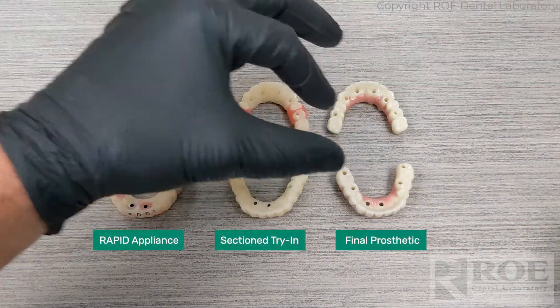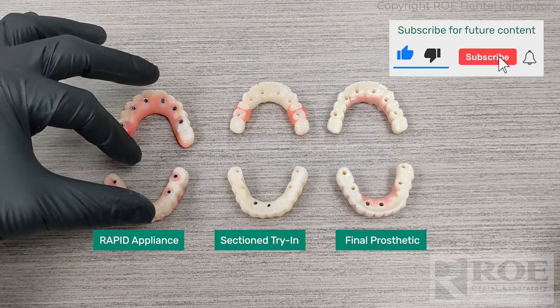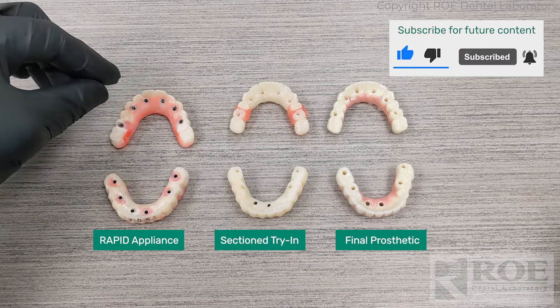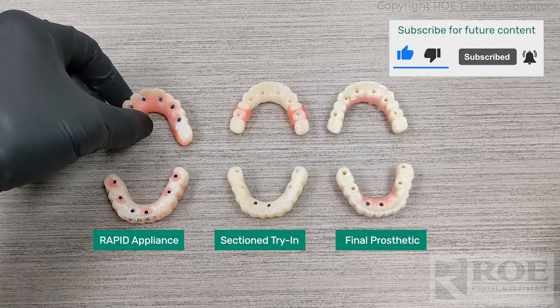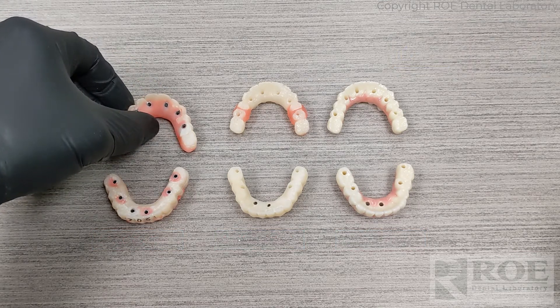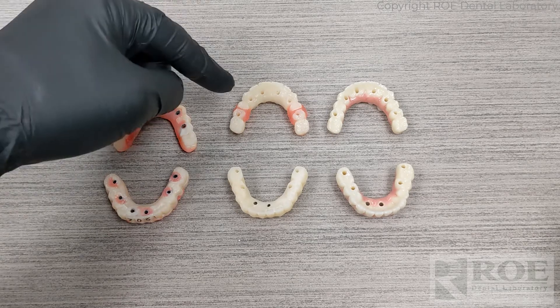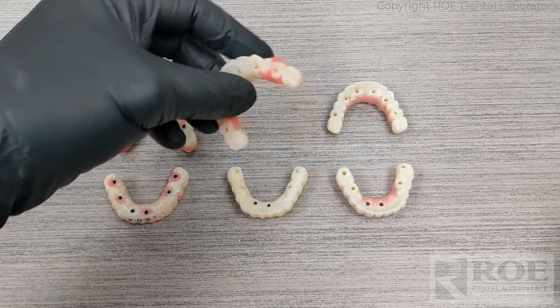This video shows three different prosthetics, three different sets. The rapid appliance was picked up during surgery, and then the patient came for the final restoration. The rapid appliances were seated, equilibrated, and a bite was captured and sent in for printed try-ins.